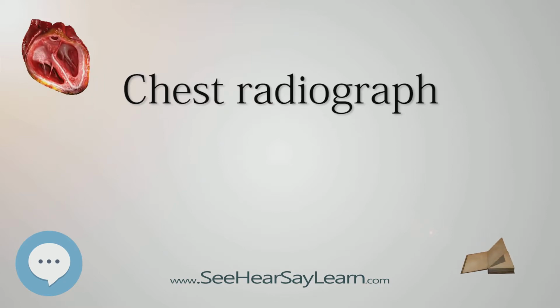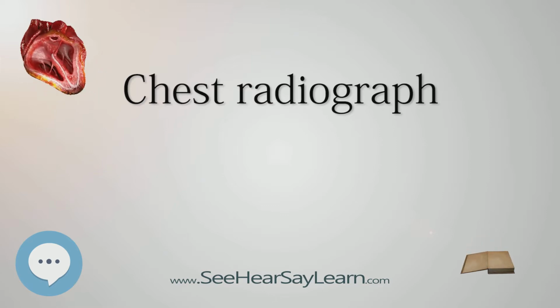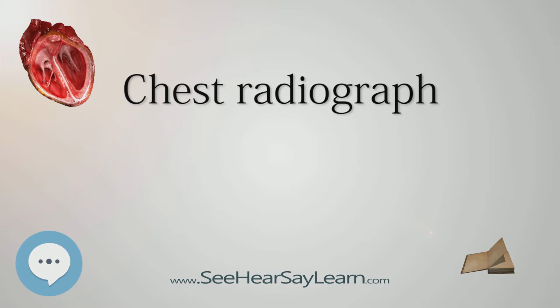Calcification. Margin. Smooth. Lobulated. Presence of a corona radiata. Shape. Site. If the nodules are multiple, the differential is then smaller. Infection: tuberculosis, fungal infection, septic emboli.